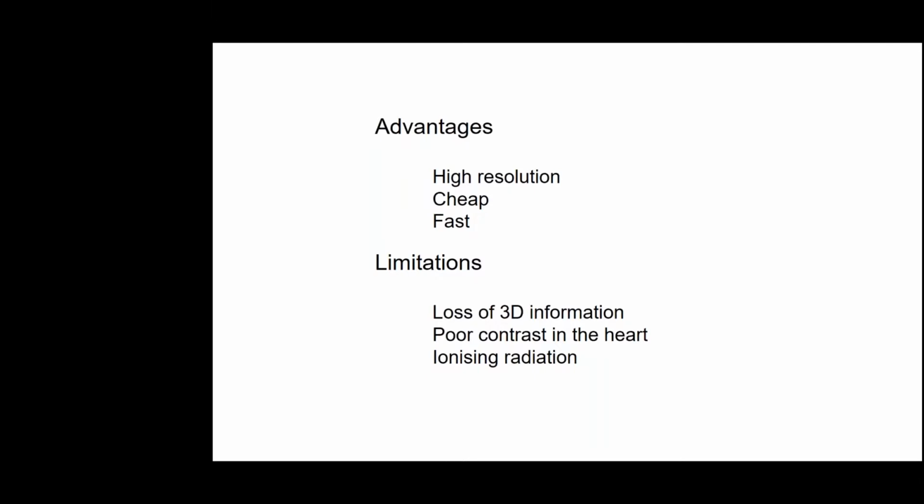Some of the limitations that I've already mentioned are the loss of 3D information, poor contrast, particularly in the heart, and the presence of ionizing radiation. So these X-rays in general are dangerous, though the amount of X-rays that are given in one of these explorations is not particularly worrying. It might actually be more of a worry to the health professionals around the table at that time, who are also going to get some of the residual X-rays, and who are doing these interventions on a daily basis.